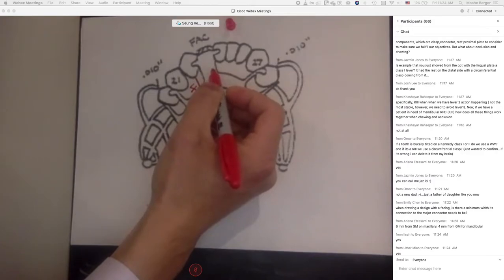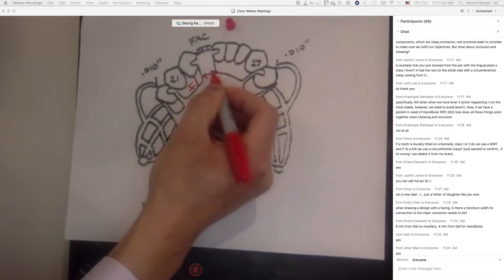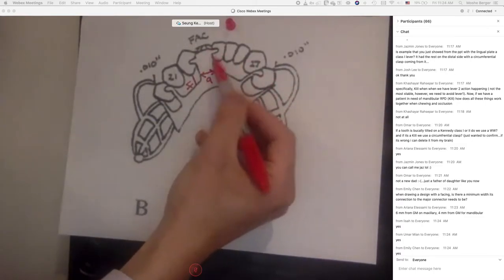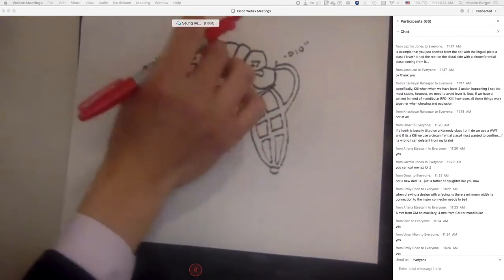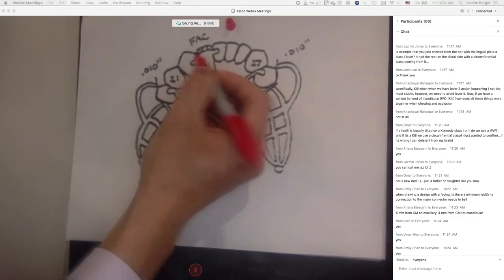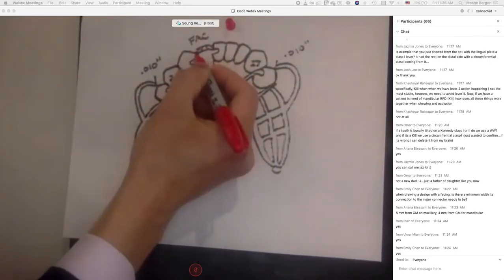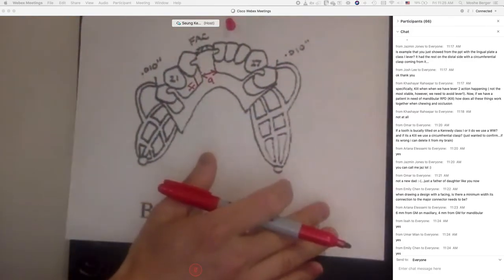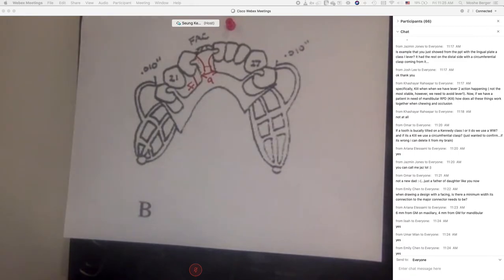Now, the question relates to the connector, or the connection between the facing, which is here, to the major connector. So width-wise, are you talking about this width? I'm going to say A. I guess that's the only width you are considering because the rest is as long as it needs to be, going to the denture area. So that width depends on this edentulous area. If this width was, let's say, from height of contour of 22 to the height of contour of 25, or 24, 5 millimeters, that should extend so that this line is basically parallel to that confined space. Obviously, you don't want something like this where any narrowing of the width is going to weaken the connection.